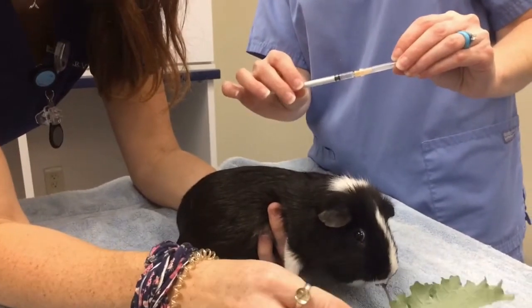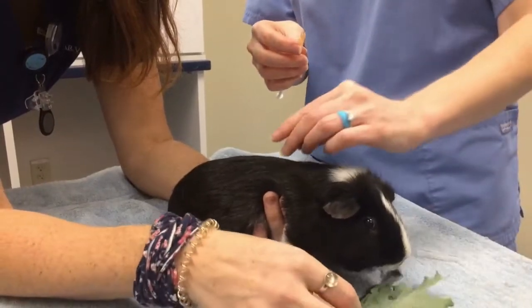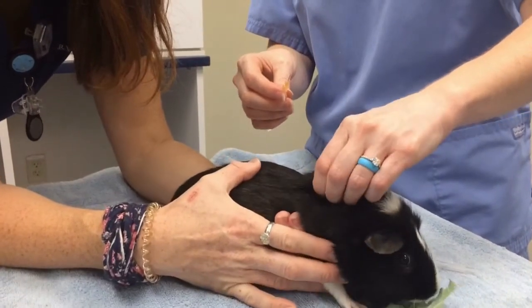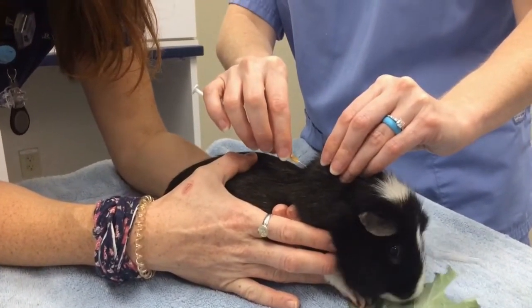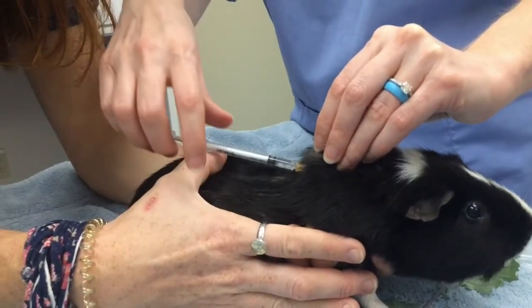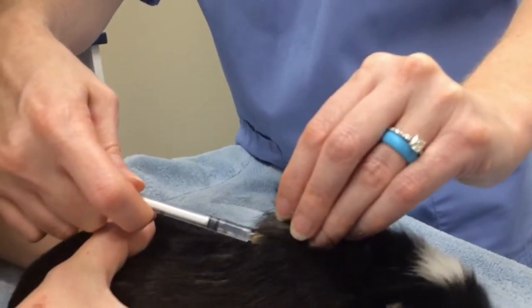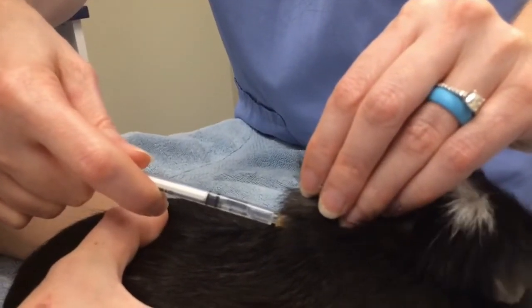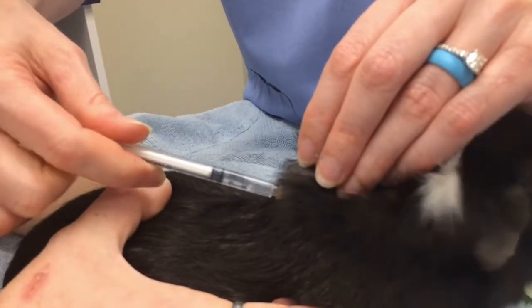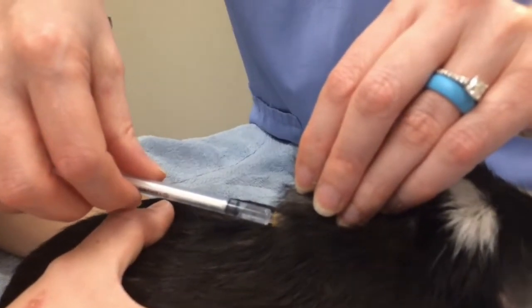Once you're ready and have your medications drawn up in your syringe, you're going to take the needle off very carefully, then pinch up in that shoulder area. Give a pinch on the skin right here, then inject right into our little teepee — all the way in. You'll feel a little bit of a give once you're through the skin. To make sure you're underneath the skin, pull back on your syringe to get negative pressure. When I let go there's no air and it goes right back to where it was, so now I know I'm underneath the skin and you can give the injection.